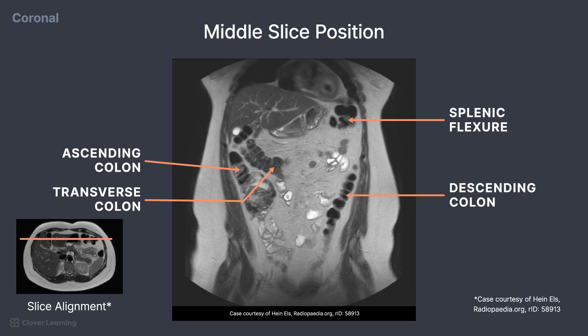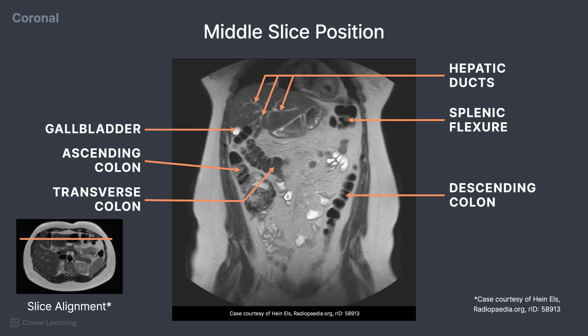In the liver, some of the hepatic ducts are visible as bright areas, and a small portion of the gallbladder is located towards the inferior portion of the liver.